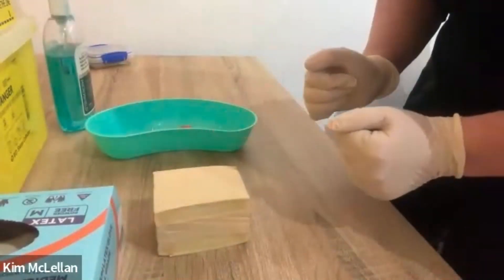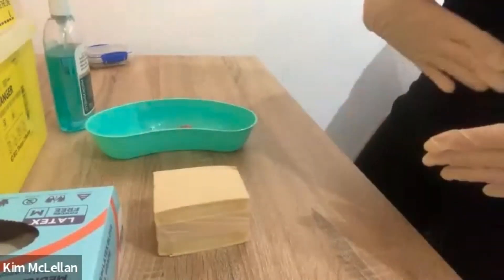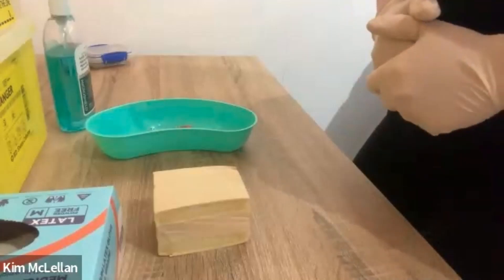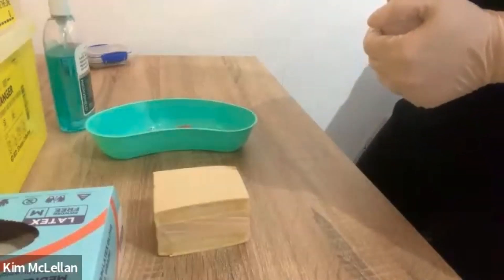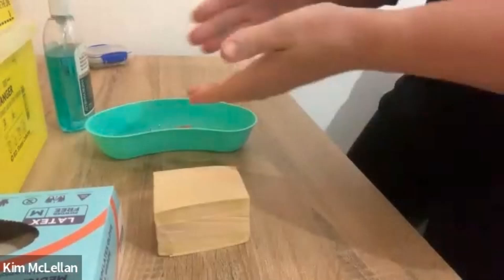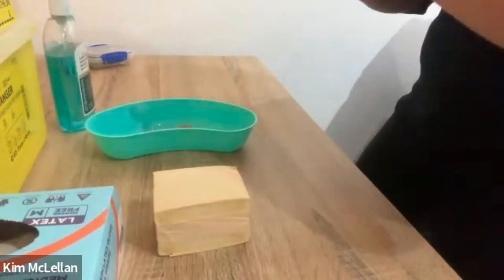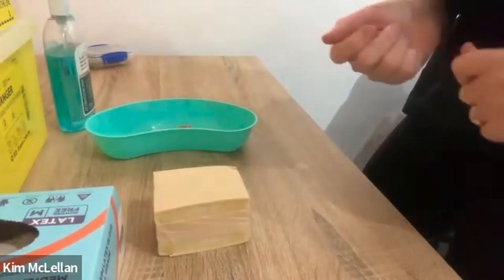There's no bleeding there — it looks like it's going to be okay. Try not to rub or scratch the area for a little bit, it just needs to settle. You'll be able to have some dinner soon. Remove my gloves, wash my hands, and then I'm going to sign my drug chart to say that I have administered the medication.